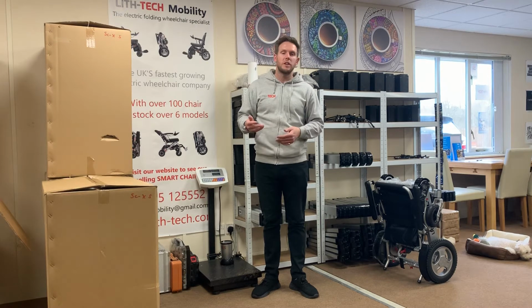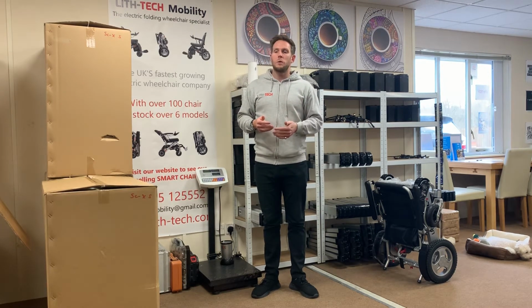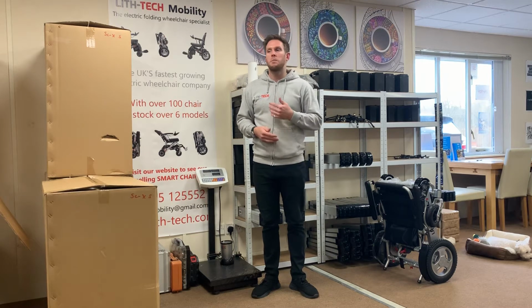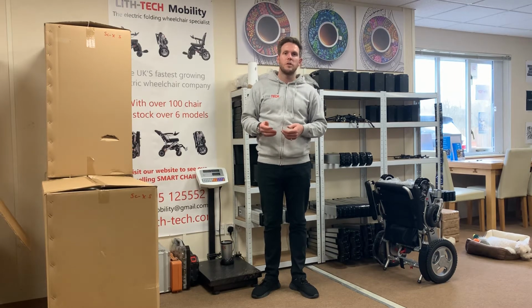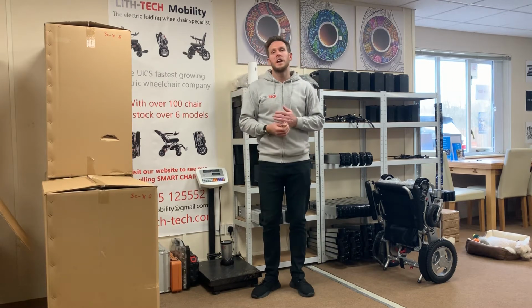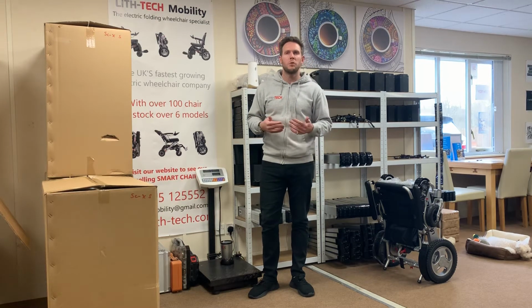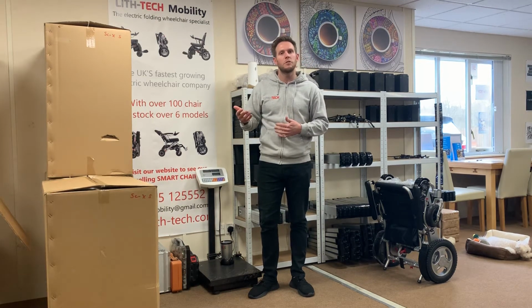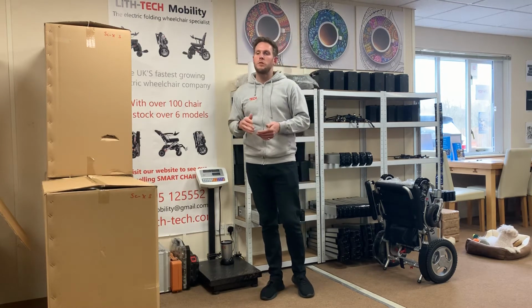You know, it can be used inside, outside, so they're completely diverse, because people literally want to be able to take their chairs anywhere with them. They want to be able to play with their kids in parks, they want to be able to go on holiday, up and down ridiculously high curbs, which places like Spain and Italy are full of, and they don't want to have anything get in their way of what the chair can be used for, or stop them being able to go to certain places just because they're wheelchair bound. So tyres are incredibly important.